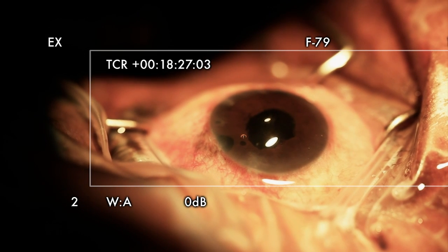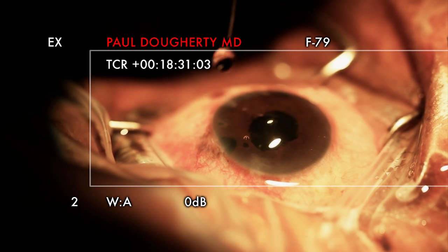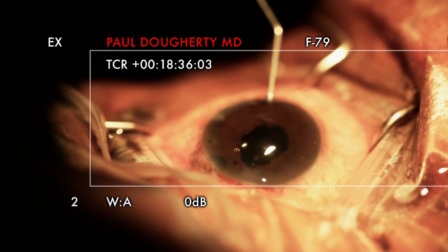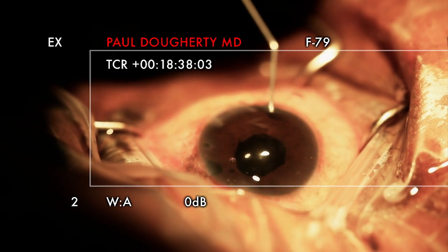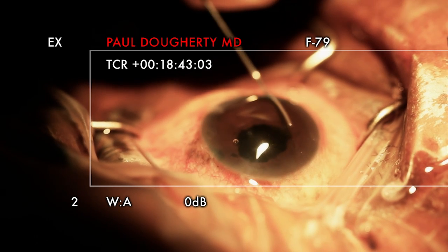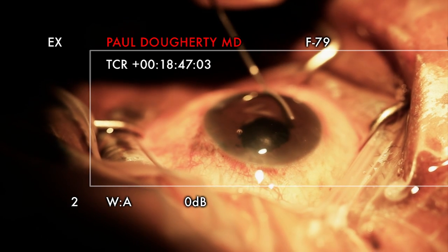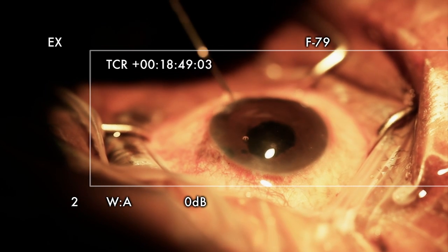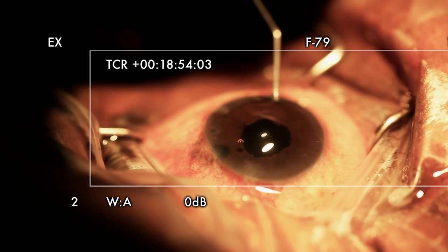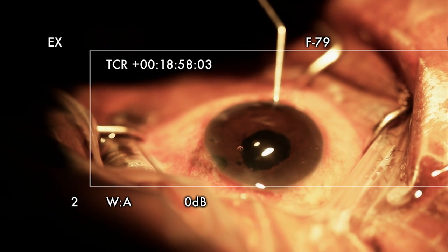Do you want this camera out of the way? Because we're done with the camera. I'll do a voice over. This is one of the most difficult cataracts I'll have here — when you see this image on the computer you're going to be like, oh my god. This one's easy to remember because it's pretty unusual.